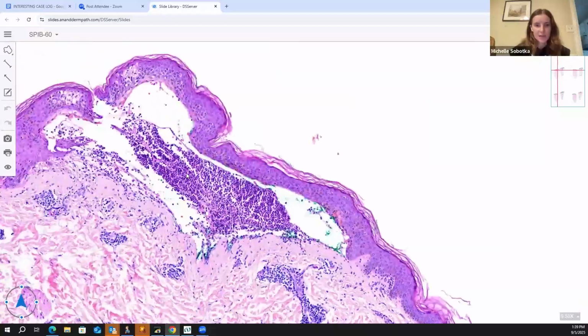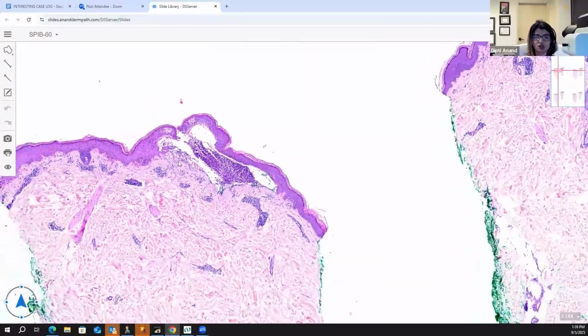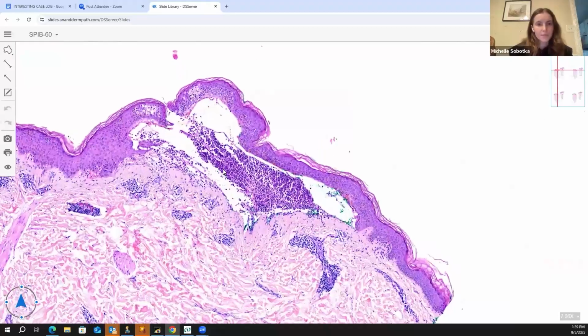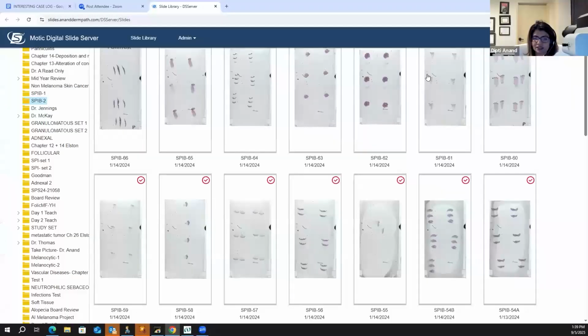So it could be like dermatitis herpetiformis, linear IgA. Yes, yeah. And because this is more of a linear split, this would be linear IgA or bullous lupus or chronic bullous dermatosis of childhood. Okay. Everybody good with that? Okay. The next one is E1.